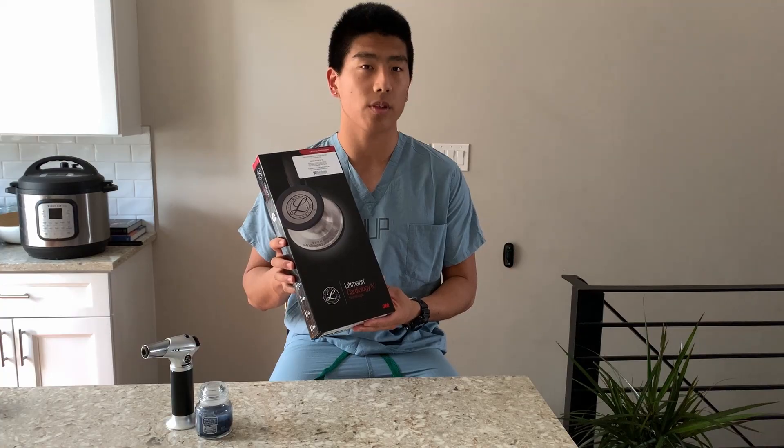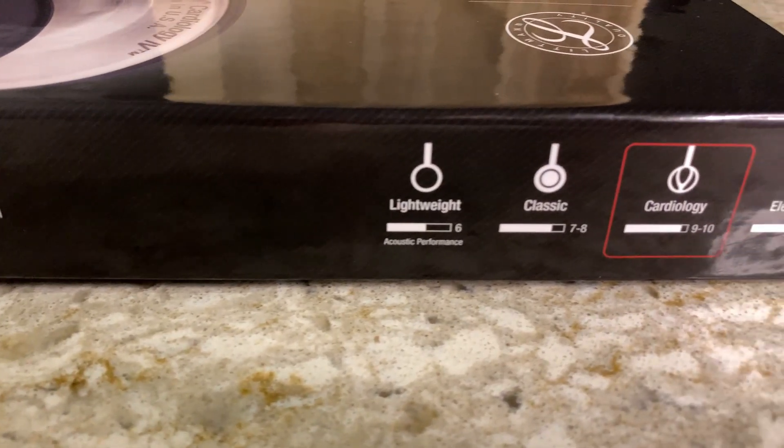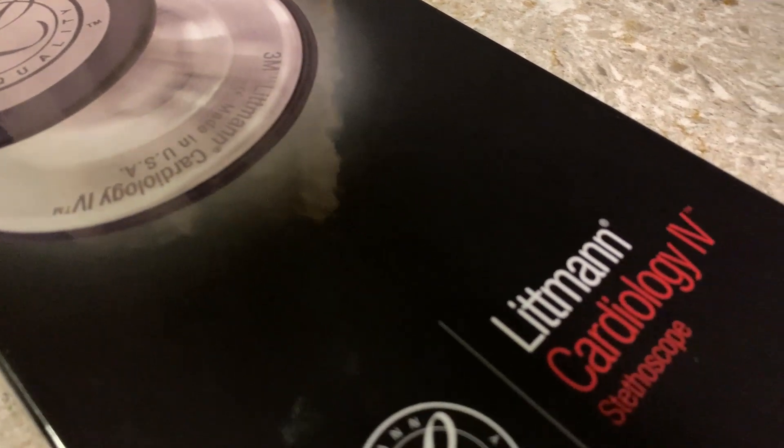Hi, my name is Royce and I'm a first-year MD PhD student at the University of Pennsylvania. In this video, I'm going to be unboxing my first stethoscope ever. This stethoscope, the Littmann Cardiology IV, was gifted to my medical school class at UPenn. This is a super legit stethoscope that cardiologists use and so I'm really excited to take a look and see how it works.